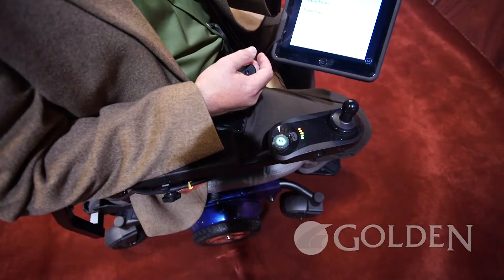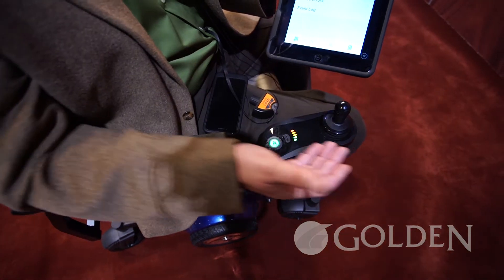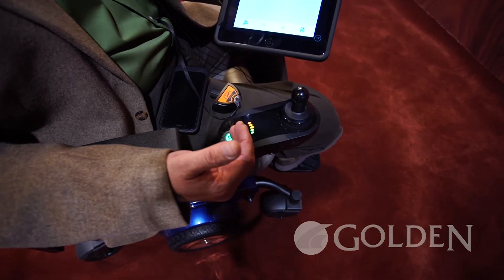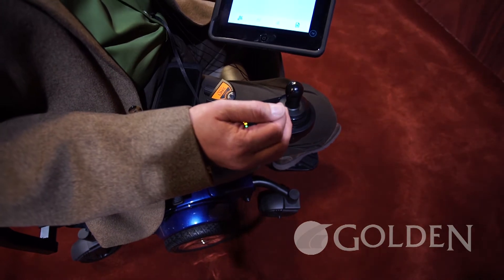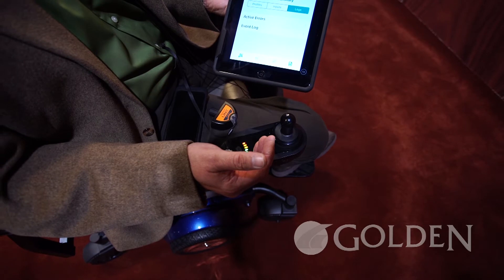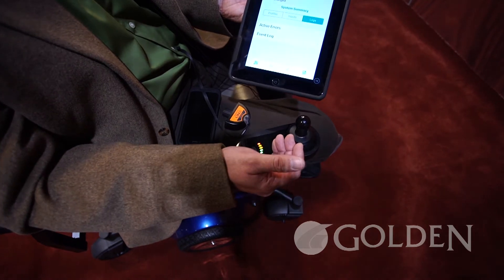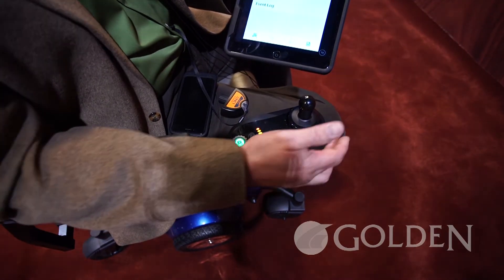We start off with a hand control. It's really nice and unique with slim features here. Everything is recessed back and contoured so you're no longer reaching over the joystick to turn it on and off, which will prevent lockouts on the unit, as well as serve as a safety feature to prevent transferring and then hitting the joystick and having the chair move. We put the charging port on the side instead of in the front.